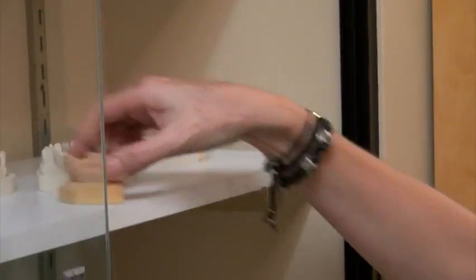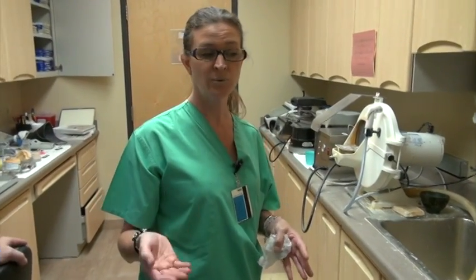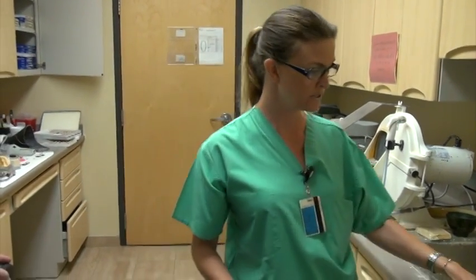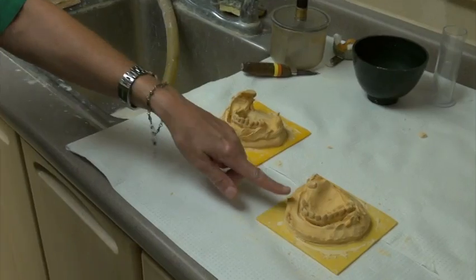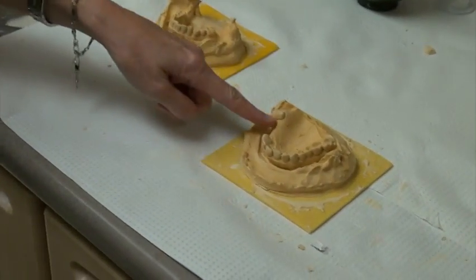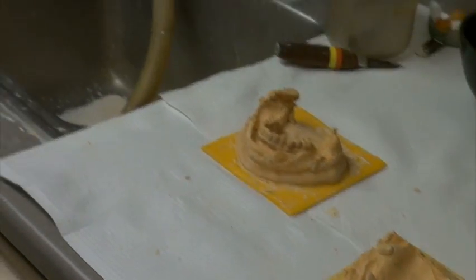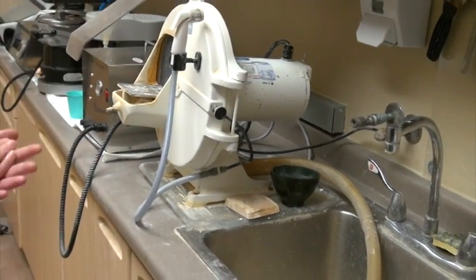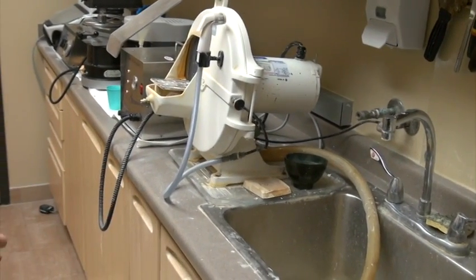This is a dental laboratory. What we do in here is that once a person needs to have teeth replaced, we make an impression of their mouth, and then we pour up that impression, and then this is what the result is. And so once the impression is poured up, they fabricate the missing teeth here, and this is where everything is fabricated. So they fix the stone and make the mouth just the way it would be, kind of recreate the mouth per se, with impressions.